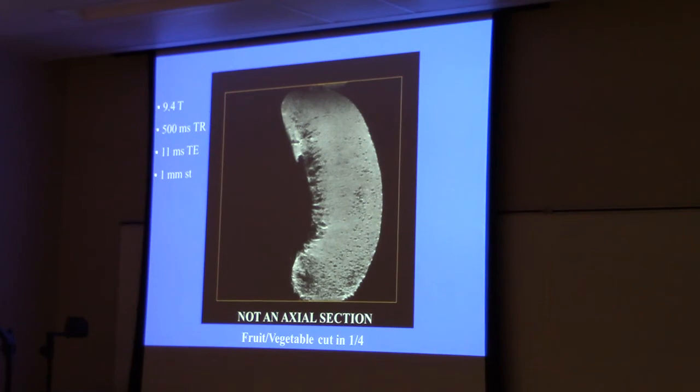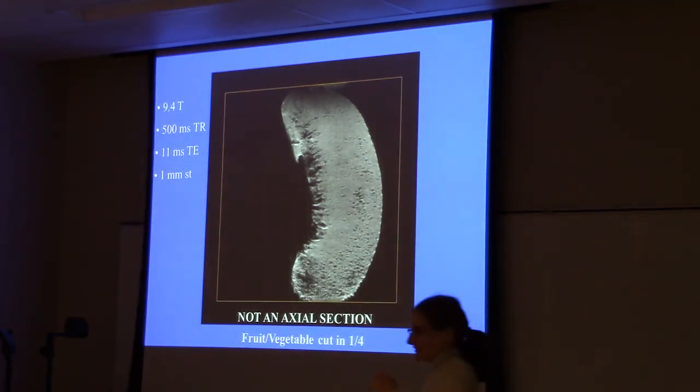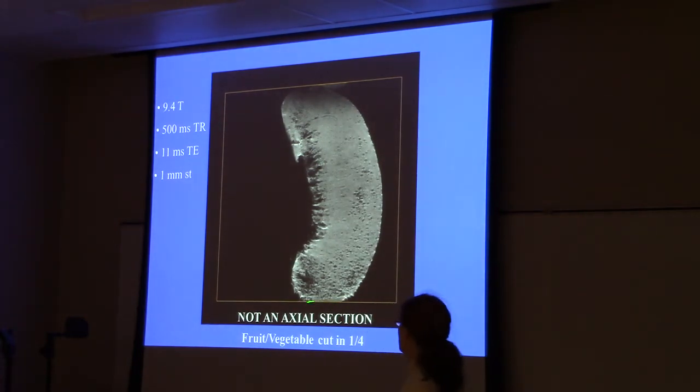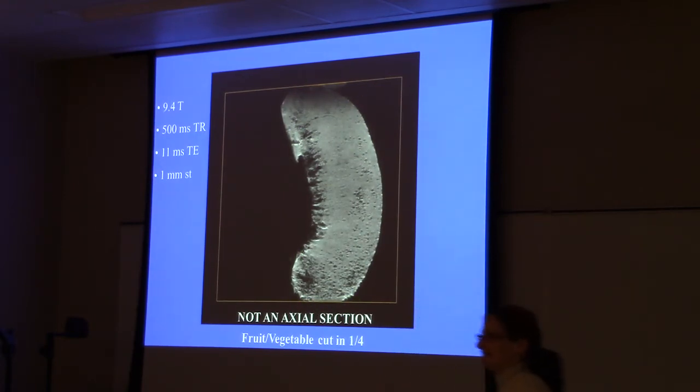Yeah, I couldn't get the whole thing to fit, so I had to take the pit out, and then I sliced it. And if you're going to come tomorrow, you'll see the game again, please don't guess. But there's something called a wraparound effect. So this is at 0 phase, and that's at 2 pi phase. You'll see there's a piece that I missed from the bottom. It shows up again on top.